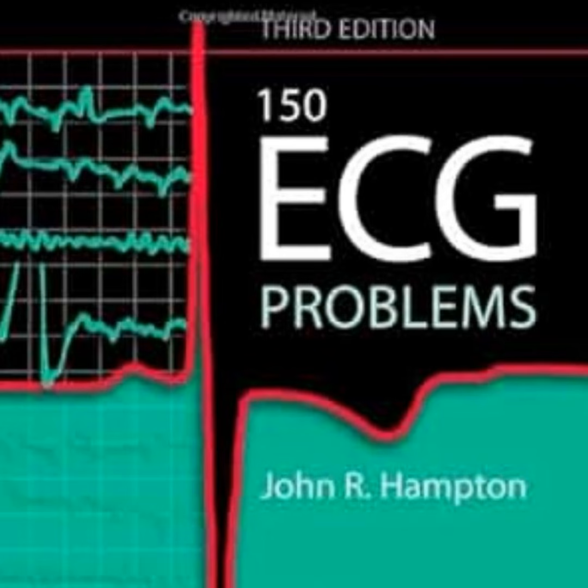Exactly. And the temptation for a busy, maybe overworked clinician might be to look at that normal tracing, feel a false sense of security, and just consider discharging them. But doing that would be completely ignoring the actual underlying pathophysiology of ischemia. Because if you're listening to this and wondering, wait, how can actively dying heart muscle fail to register on an ECG? Well, you have to look at the timeline of cellular injury. Because it's not instantaneous. No, not at all.